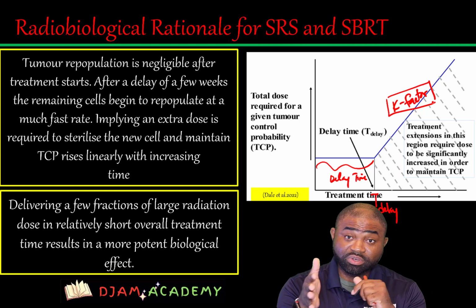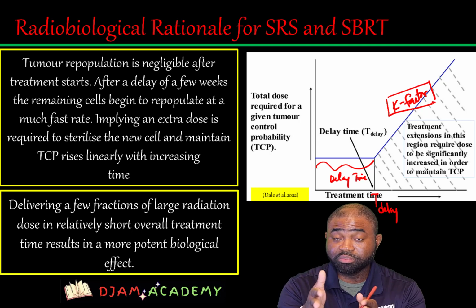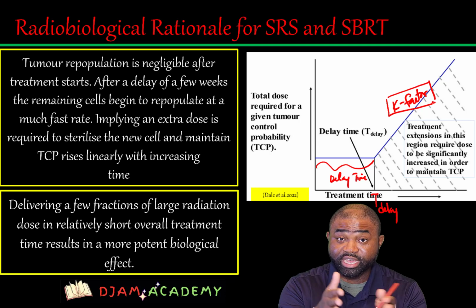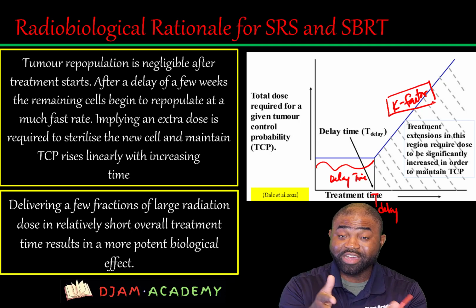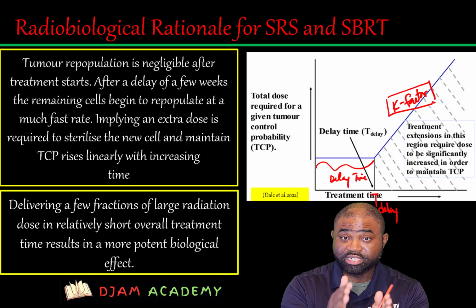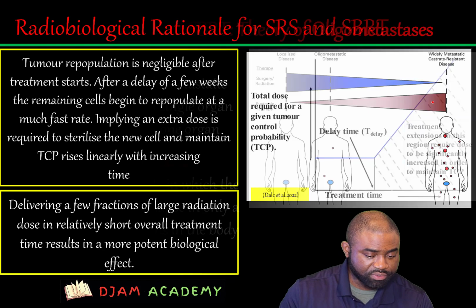Now, compared to conventional radiation therapy that typically spans up to about 30 fractions, we need to take into account the extra cells that are created after the third week. And especially this becomes really significant if the patient misses treatments, especially in the last week of treatment. And we're going to talk about this in our future series.